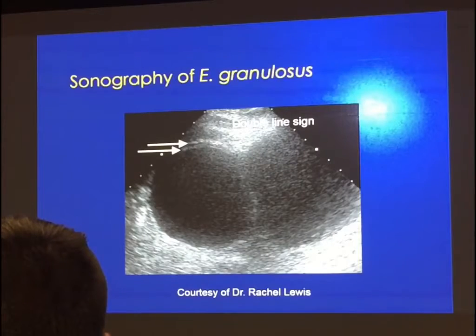So now you take the patient and have them roll side to side, it kind of agitates that sand up into the cyst fluid, and then it starts to float down like snowflakes would. And it kind of looks like the snowflakes within a snow globe. So I don't have a great example showing you that, but that's something all radiologists can look for at home.